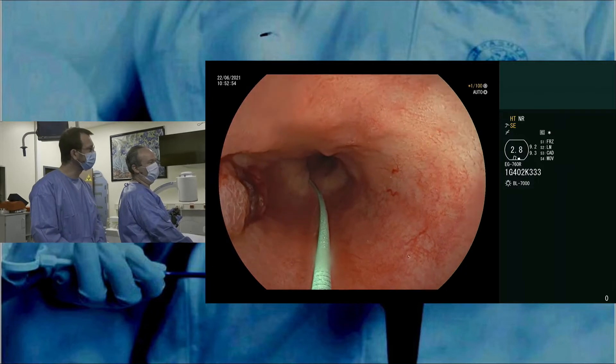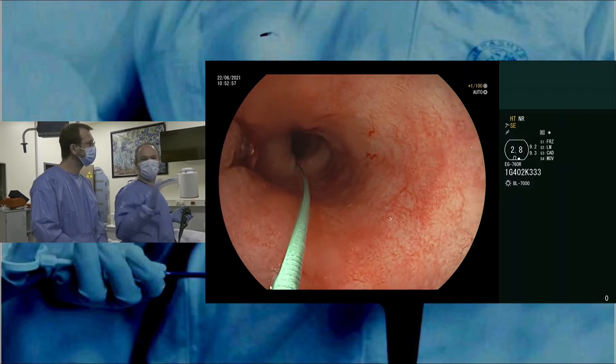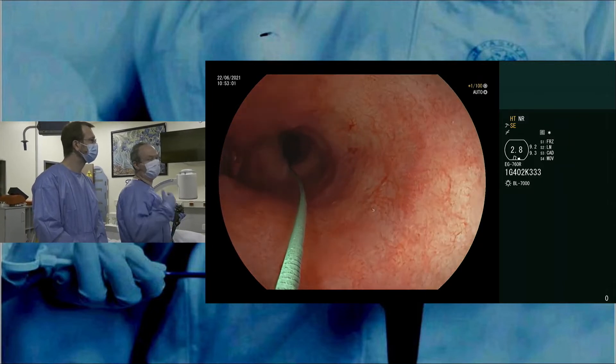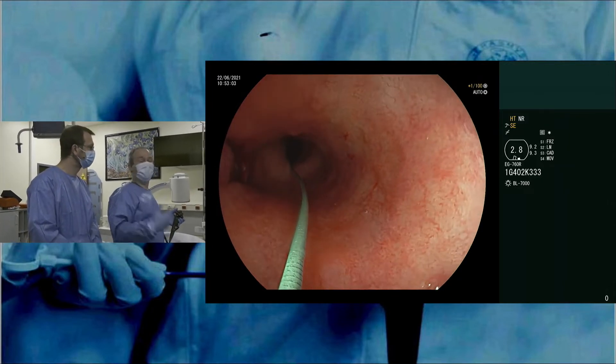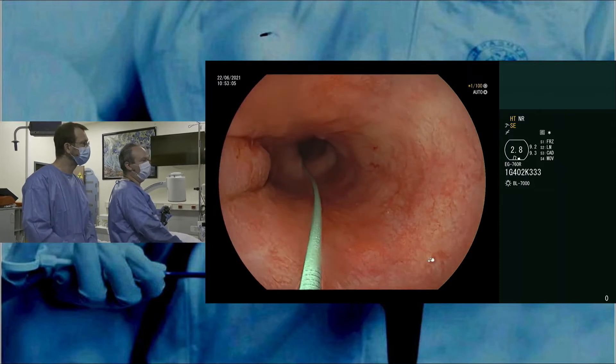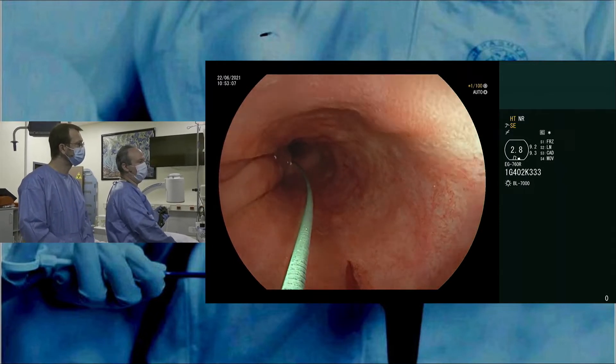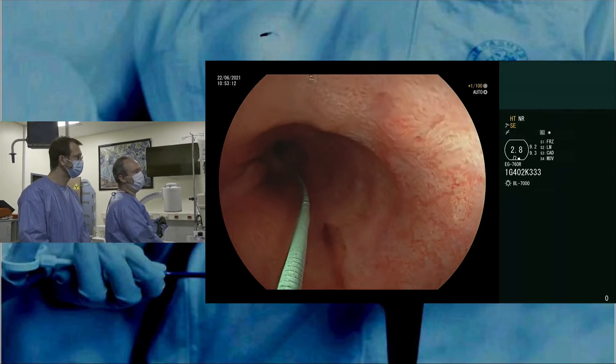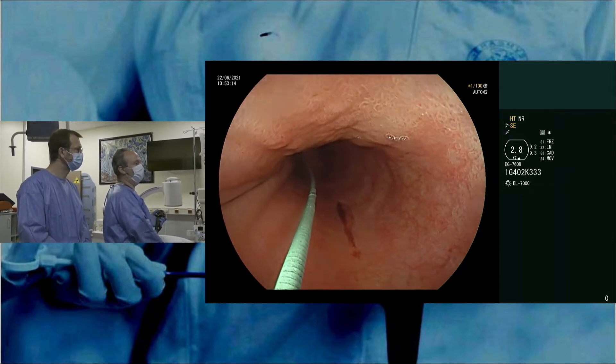So we remove it. It's definitely important to remove it and not to put the coagulation or the electrocurrent over it, because we don't know how deep the heat can go. So you can see here there's little mucosal laceration due to removal of the clip, but that's not a contraindication for the ablation.